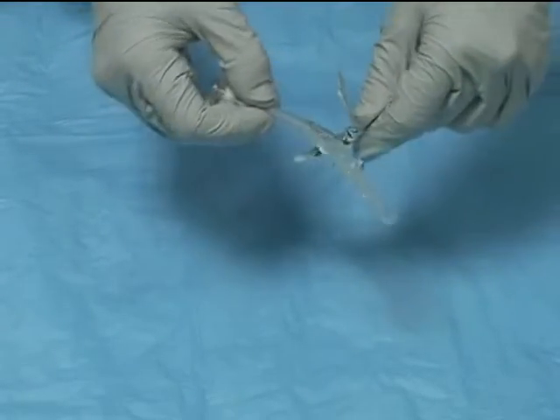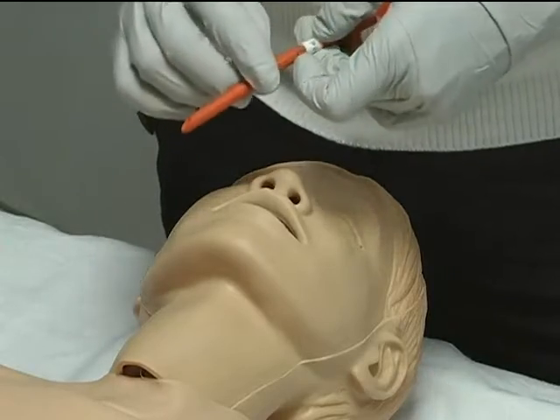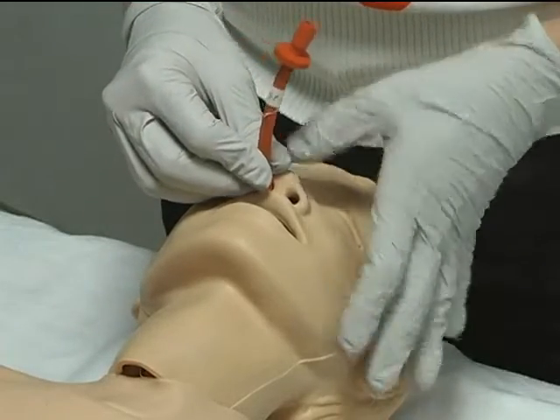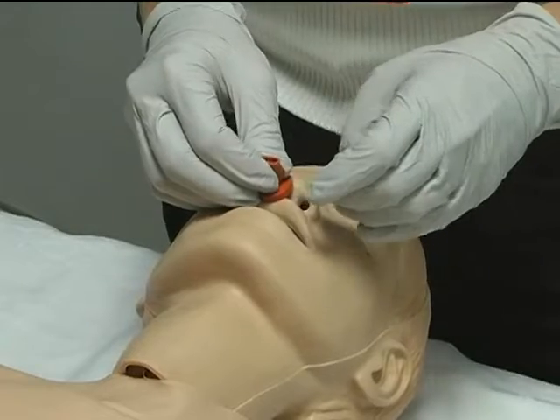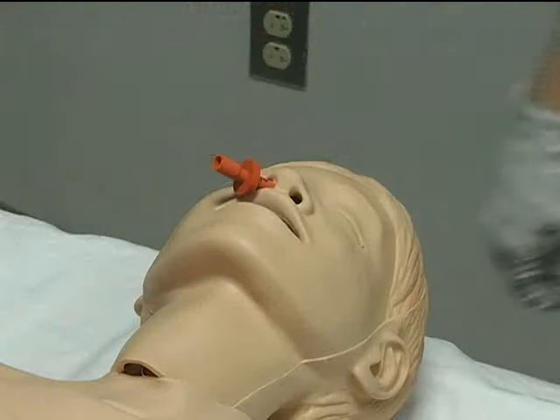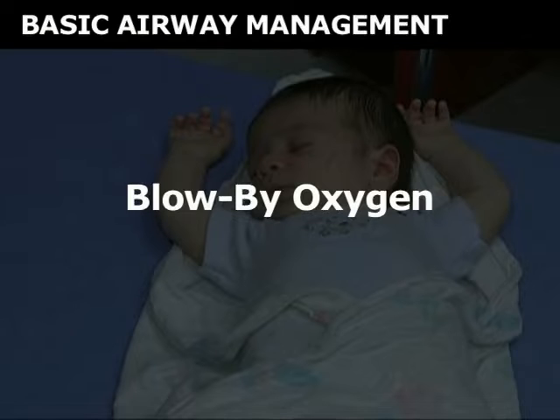Lubricate the insertion end of the NPA with water-soluble lubricant. Select the nare that seems the most patent. Insert the NPA along the floor of the nasal cavity with the bevel facing toward the septum. Advance at a caudal angle that is approximately 15 degrees. Continue until the flange rests against the outside of the nare and the distal tubing extends behind the tongue into the posterior pharynx. Confirm airway patency by assessing for chest rise, breath sounds, and oxygen saturation.